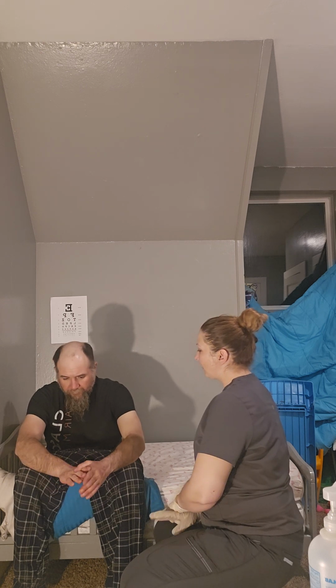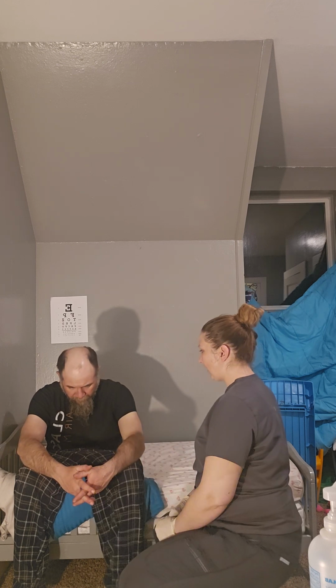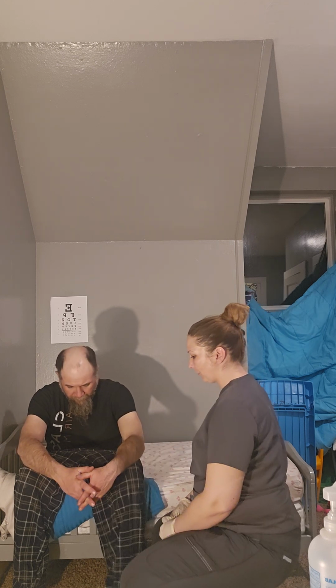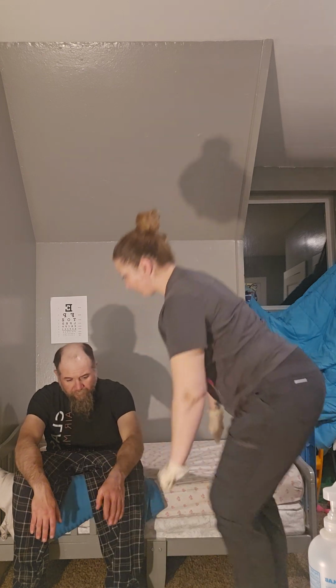No abnormal patterns of breathing per minute. And then blood pressure, we take blood pressure. 120/80 is how I would document it for blood pressure. And then I would want an SpO2 on the finger, 97%.